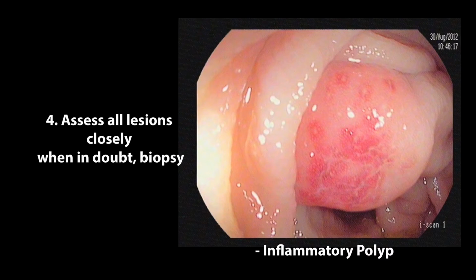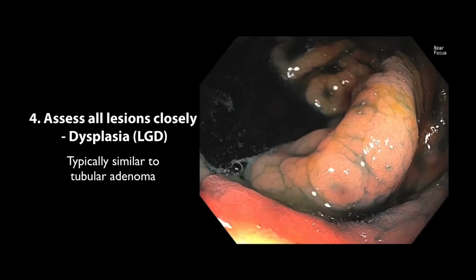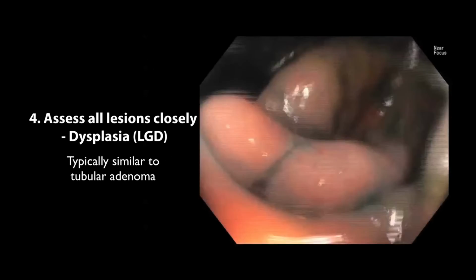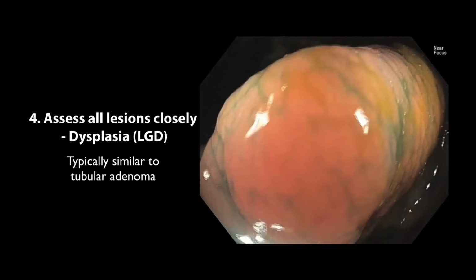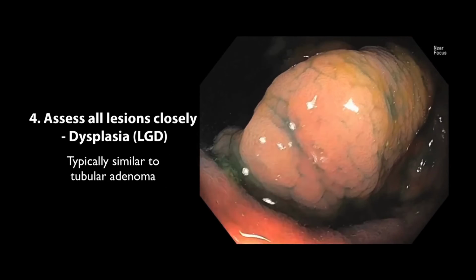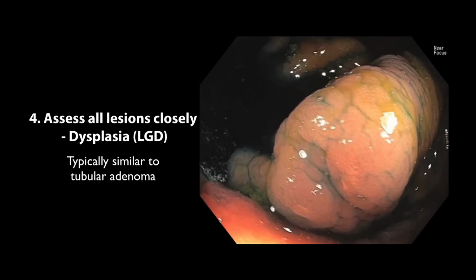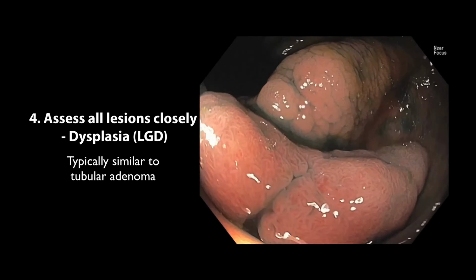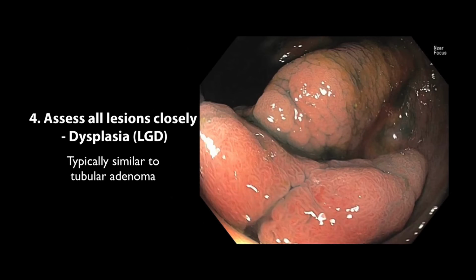This 35-year-old male with an indeterminate colitis had a 1 centimeter polypoid lesion within a colitic area. Biopsies excluded dysplasia and confirmed chronic inflammation. In this patient with long-standing chronic UC, dilute indigo carmine demonstrates a large, well-defined nonpolypoid lesion. The surface shows familiar features that resemble an adenoma and typically contain low-grade dysplasia.